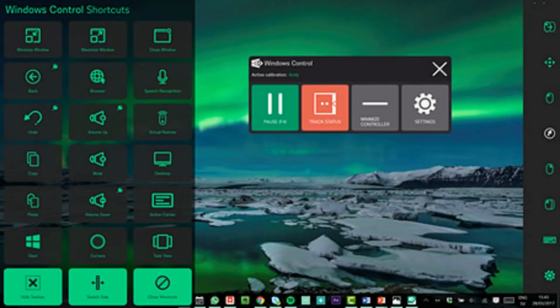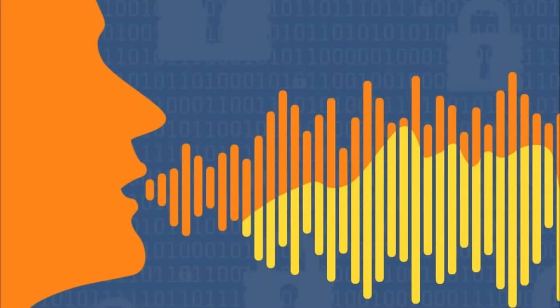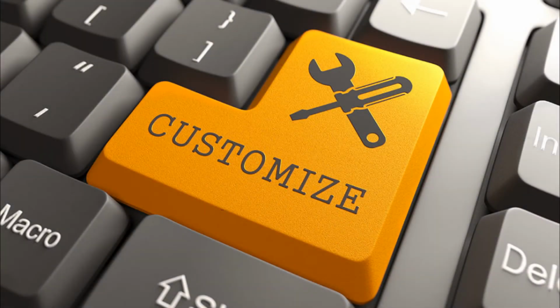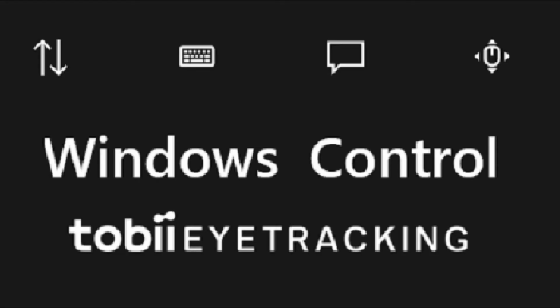Along with using Tobii's Windows control, I use a program called Nextup Talker. Nextup Talker is a text-to-speech program that allows you to speak typed words or phrases. It's a highly customizable text-to-speech program, and I've modified it to fit my needs. It's not an eye gaze program, but using it with Windows control, it acts like one.